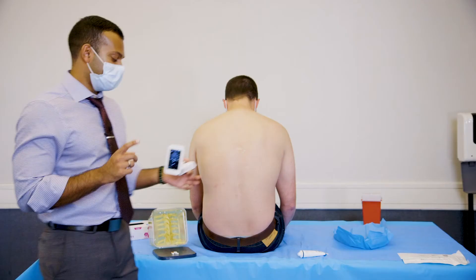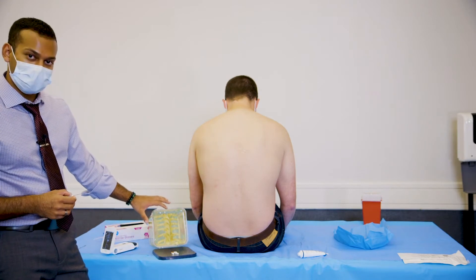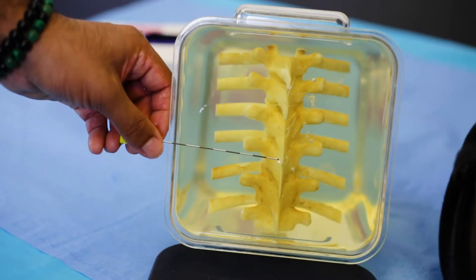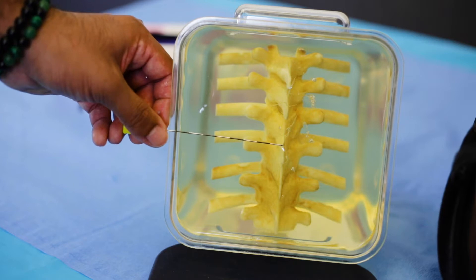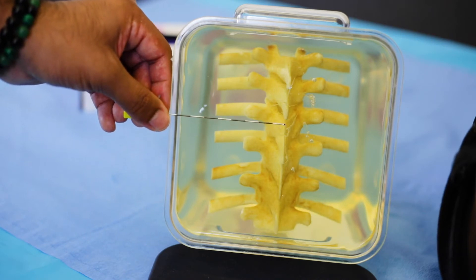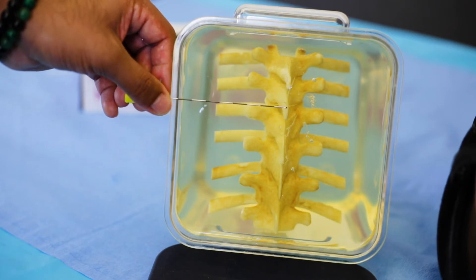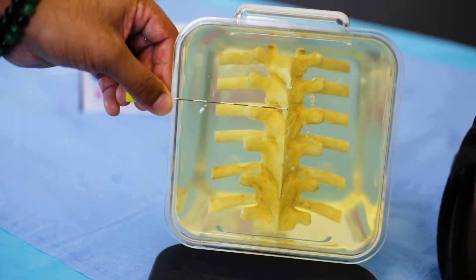Now to better understand this, let's take a look at our TrueView spine model. This gives us a great look at what we're going to see when using this device. You're going to take your probe and go over this area — this is going to be the hyperechoic line you see first, which is the spinous process. As you translate upwards, you're going to start to see the transverse processes on the sides. Once you translate further upwards, those are going to disappear and you're going to start to see your lamina. You're going to keep scanning upwards until you see the next spinous process — the hyperechoic line that is very superficial — to know your window and where you're going to place your needle.